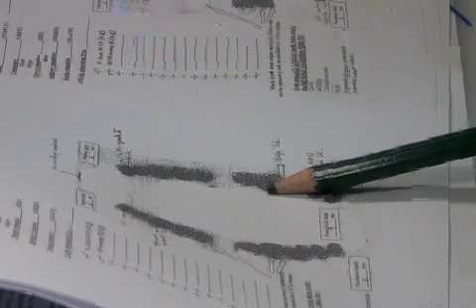Okay, high survey lines, what options do we have? In a traumatic way, lowering the survey line. Is there an atraumatic way? Now, this is interfering with what? The body of the clasp. Can I do the clasp from here and make it a reverse arm? This is an atraumatic way of changing my design without ruining the teeth. Okay? Usually high survey lines happen in mesially tilted teeth.